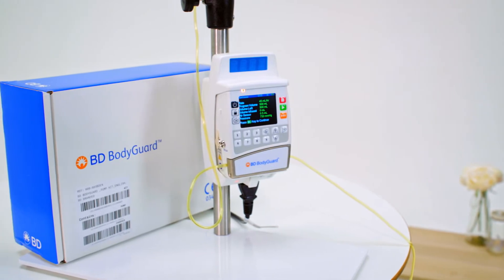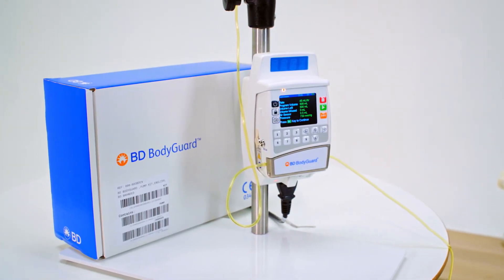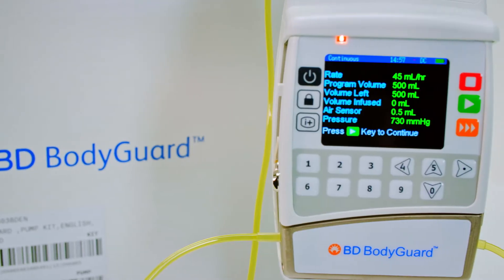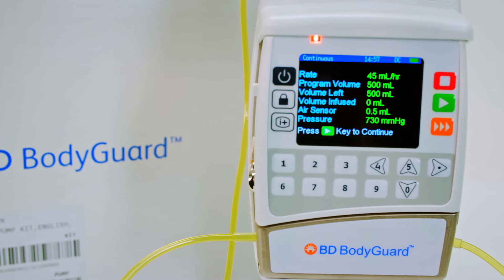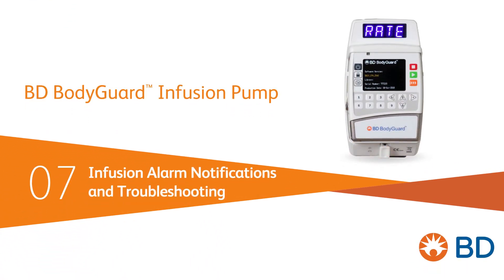The BD Bodyguard infusion pump is designed for the infusion of medications or fluids, promoting safety across care settings. Our last video provided guidance whilst the infusion is running and how to stop an infusion. In this video we'll look at the pump's alarms and notification statuses.